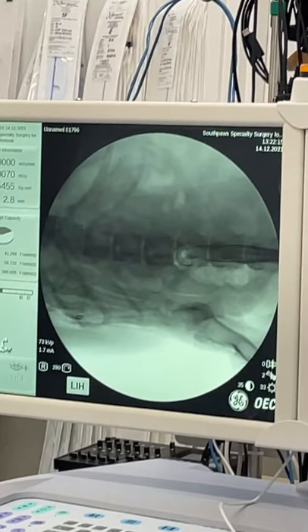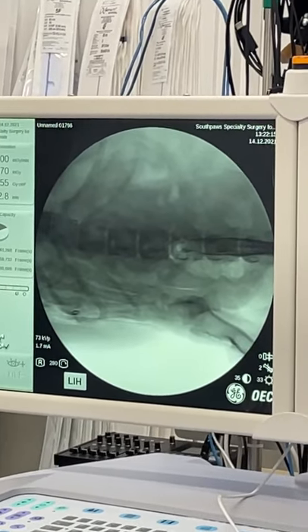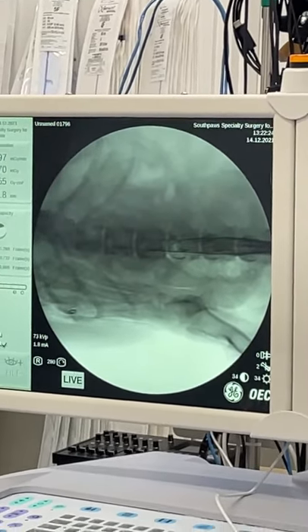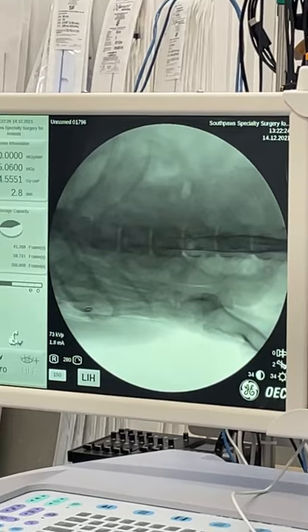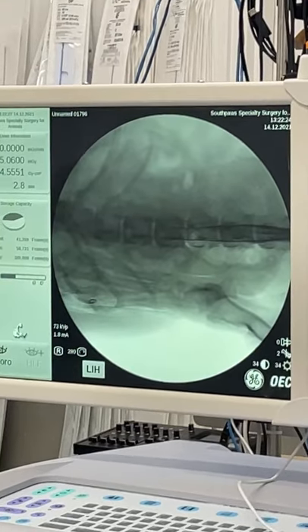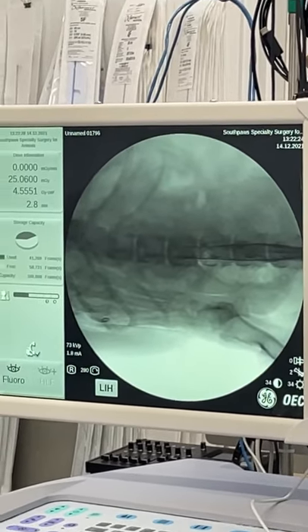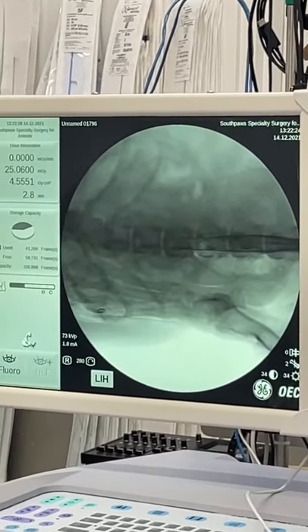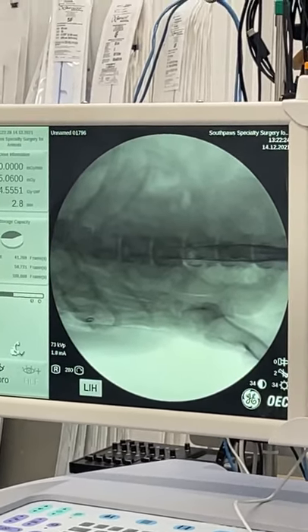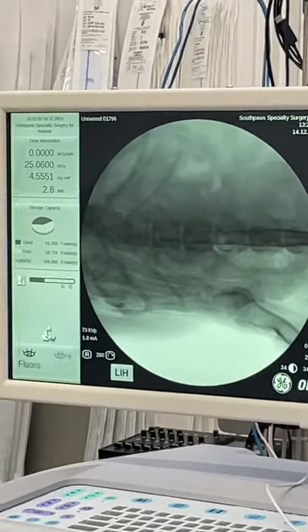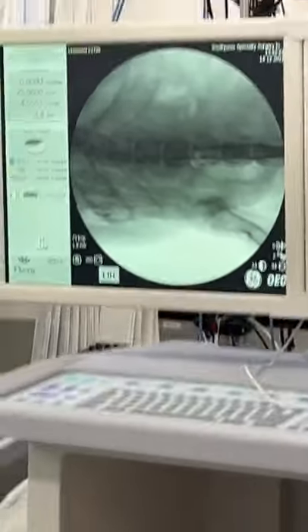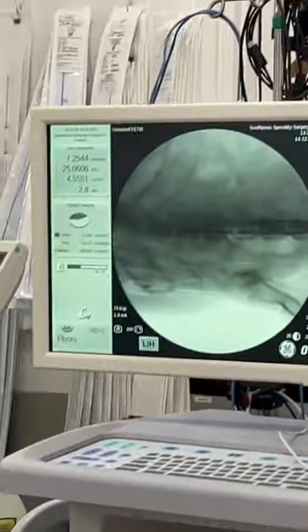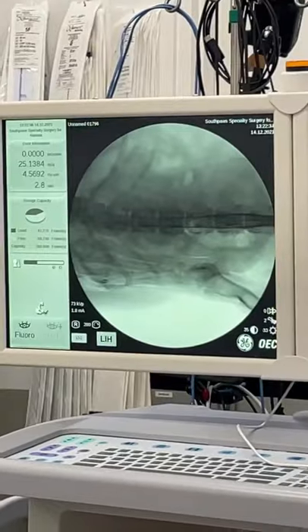There are a few little air bubbles going in which is not a concern, because before they had myelographic contrast they used to actually do pneumomyelograms, which is just air injected into the spinal canal.